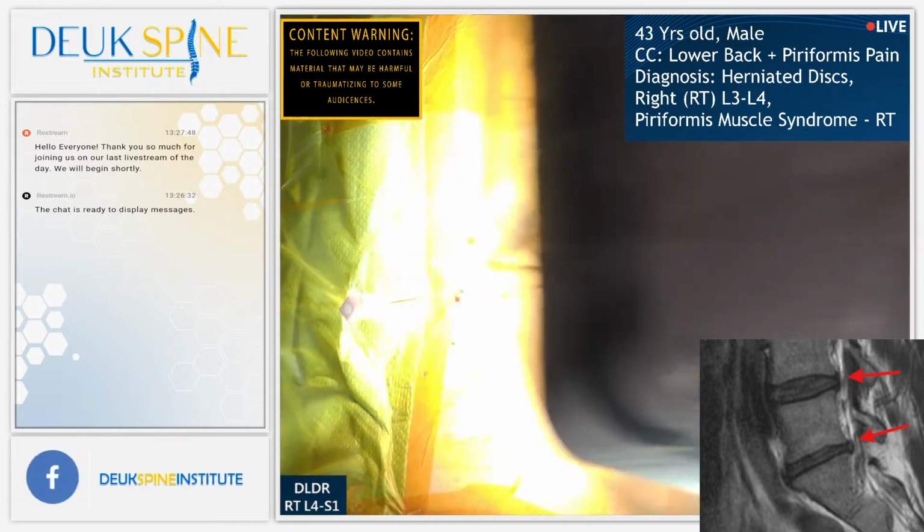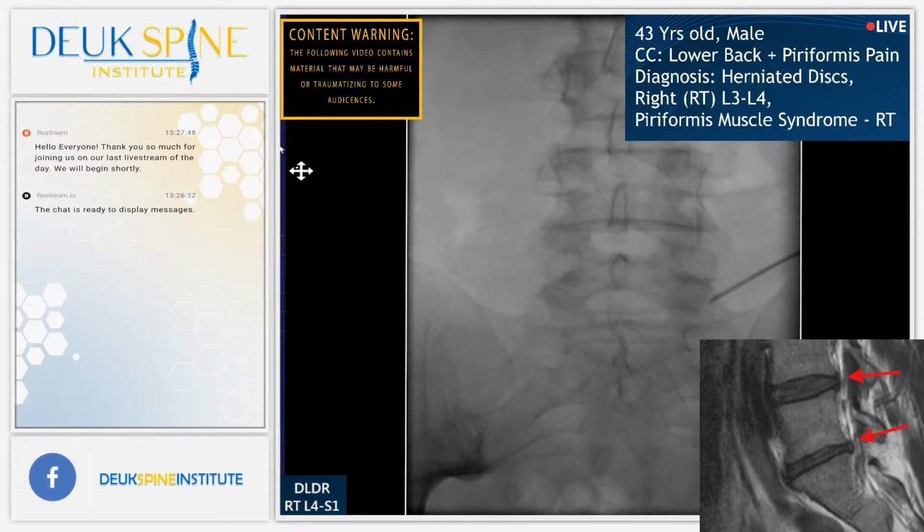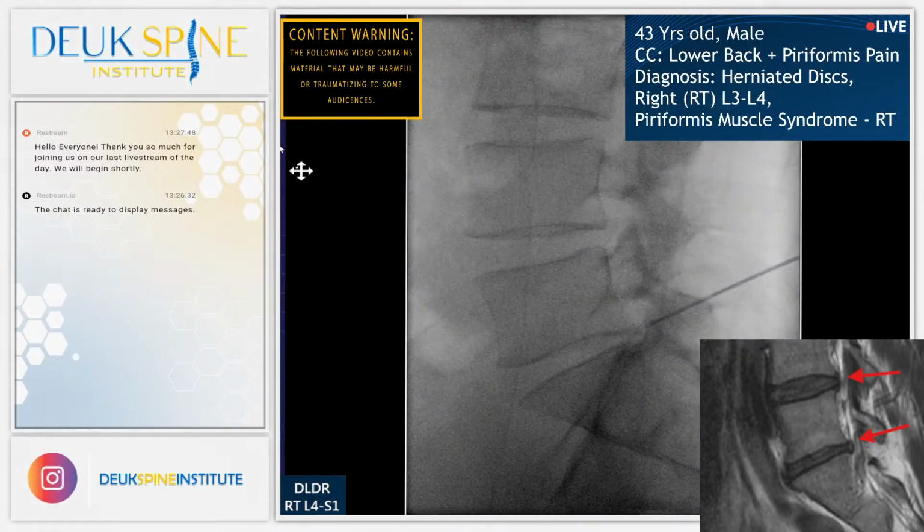Perfect. Doesn't get any better than that. He was asking me before surgery, am I going to have trouble getting into L5S1? I said, I don't expect to, because your facet joints are normal size. But you can actually see part of his facet joint is missing.